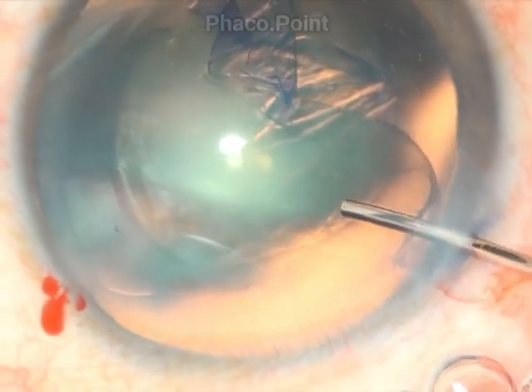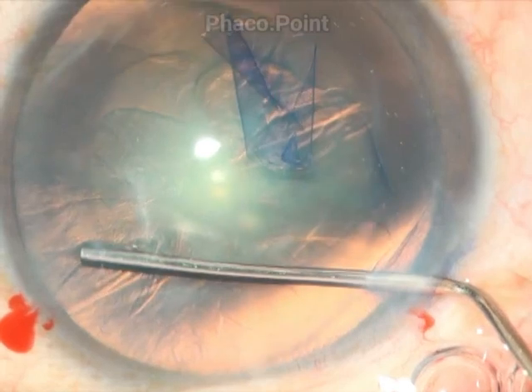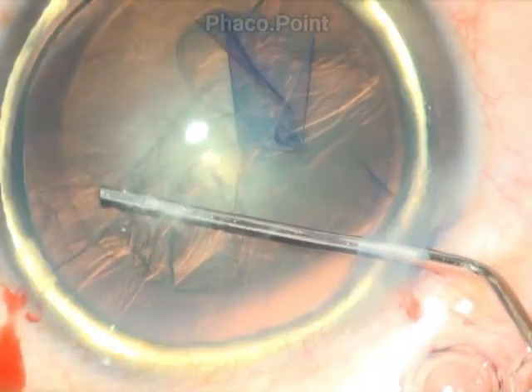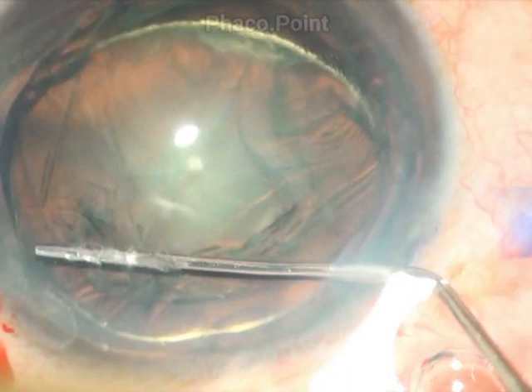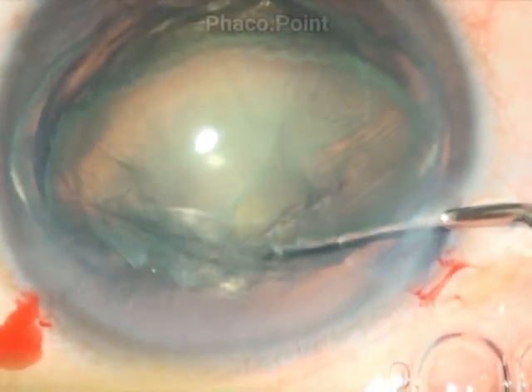Yet another case of hydrodissection. The surgeon decompresses the anterior chamber, goes deep to the rhexis, and injects — you can see the wave going all the way around. Here's the second wave, which results in hydrodelineation and the elevation of the nucleus out of the capsular bag.